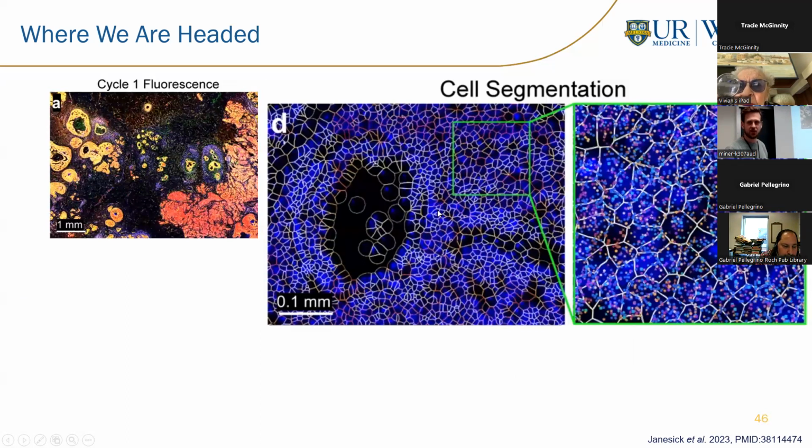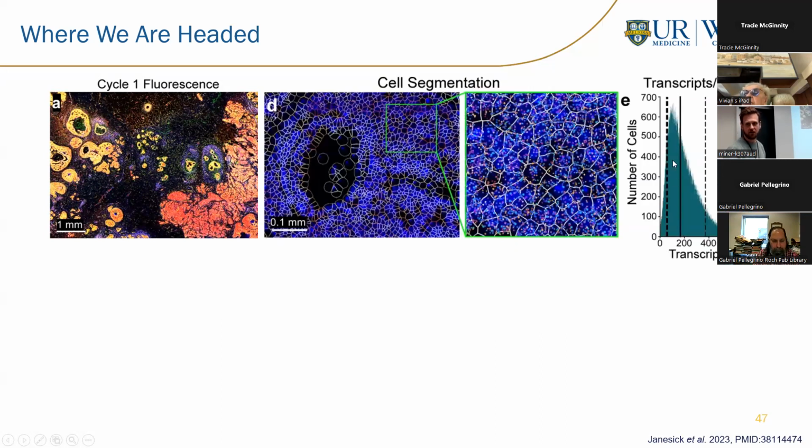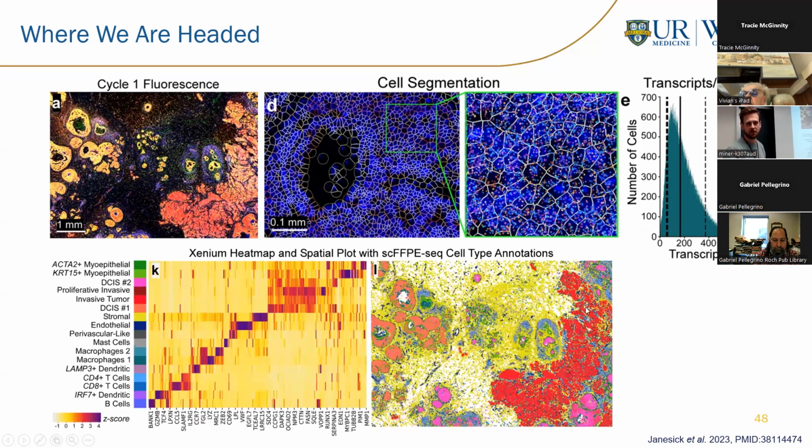The system uses, again, an AI-based segmentation program, right? This is coupled with an H&E stain done on the slide after the fact, but it essentially outlines where a cell is based on transcriptional pattern and marks that off, right? And you can see all the little fluorescent dots in here showing the different transcripts. Pretty good resolution. And again, you're on average looking at just under 200 per cell. There's 300 some on this panel, but on average, you're reading just under 200 per cell.